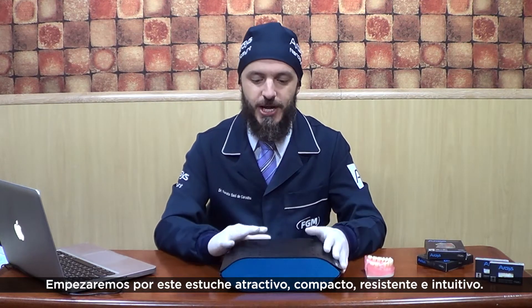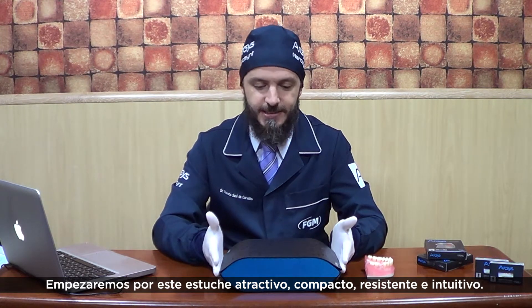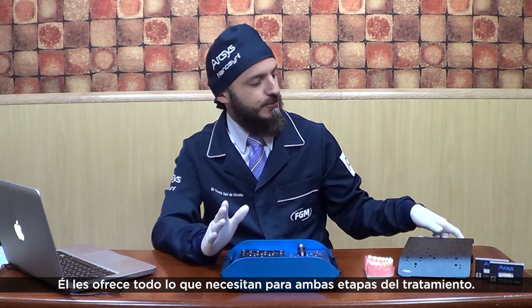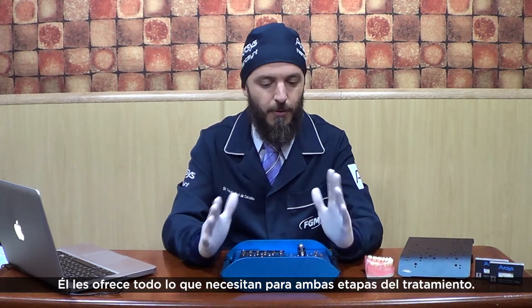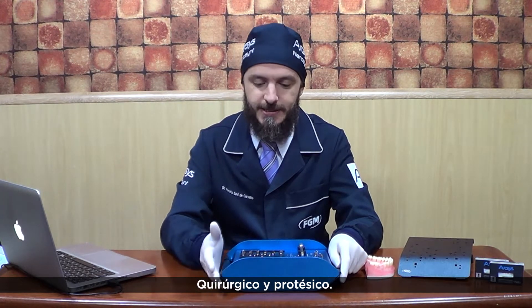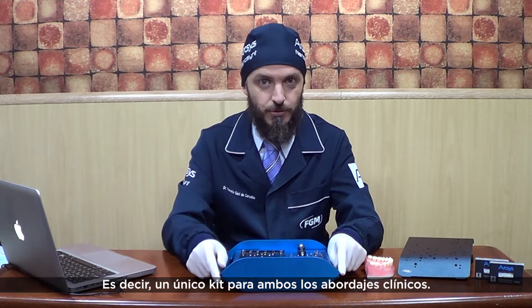Let's start checking this very attractive, compact, resistant and intuitive case. It offers you everything you need for both treatment stages, surgical and prosthetic. In other words, a single kit for either clinical approach.